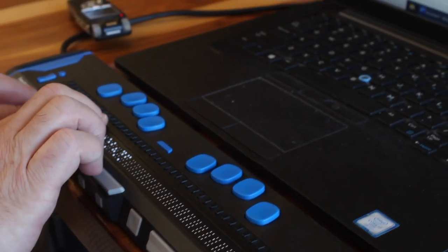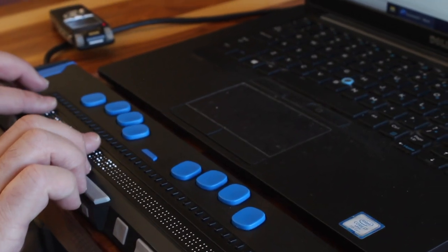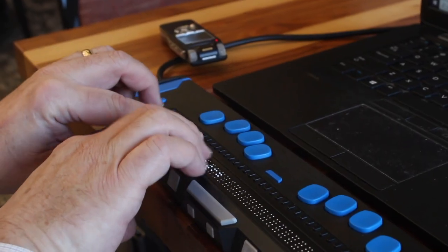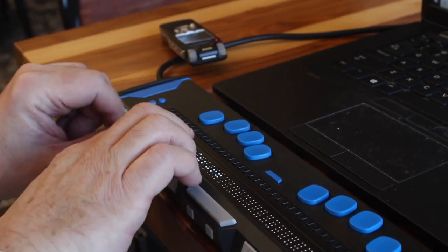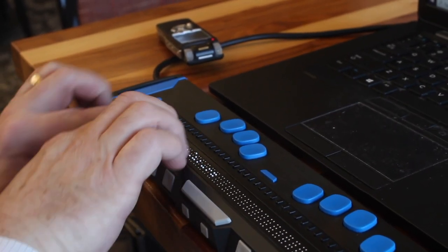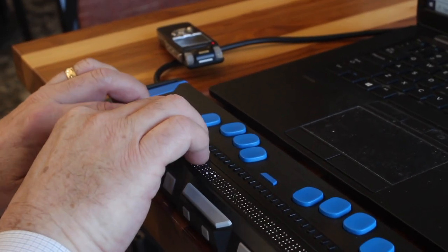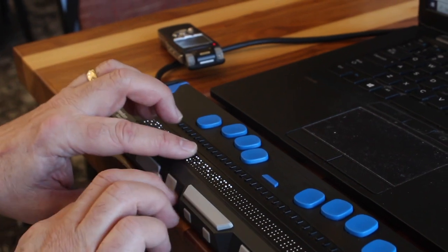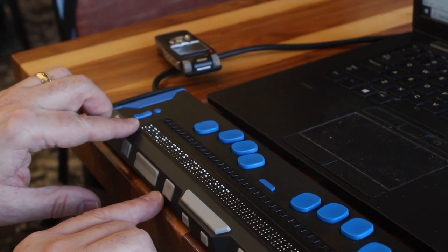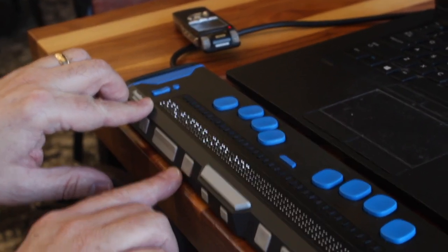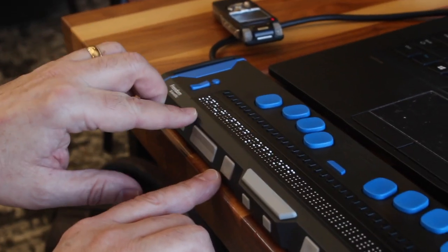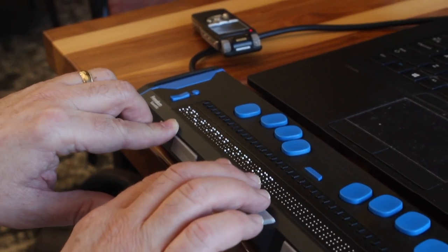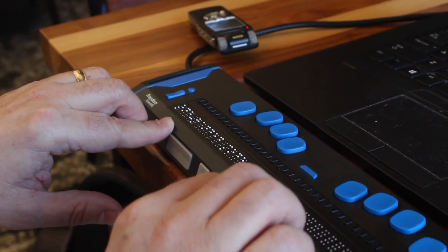Now we're in the menus. I can use the rocker bars up in the front. We'll navigate up to one-handed mode off. For those of you who can sight-read Braille, it says one-handed mode off.